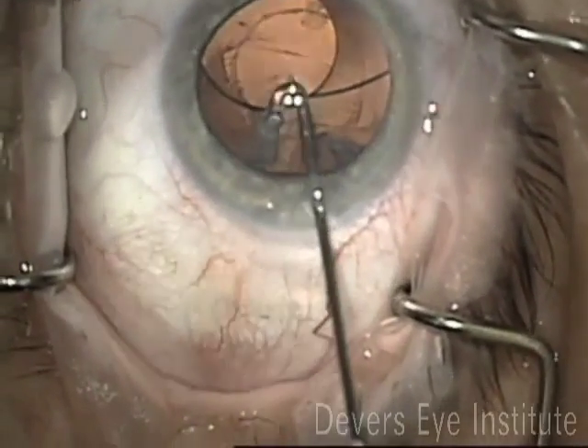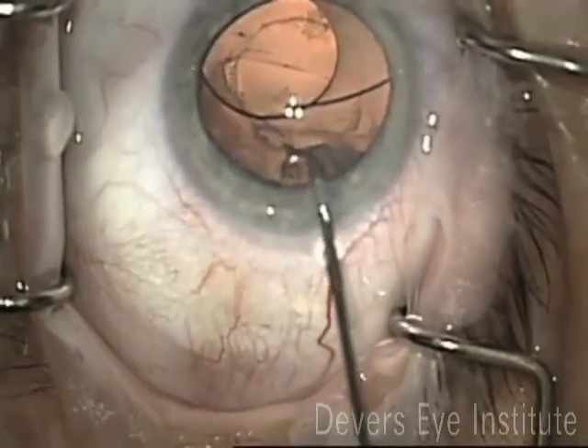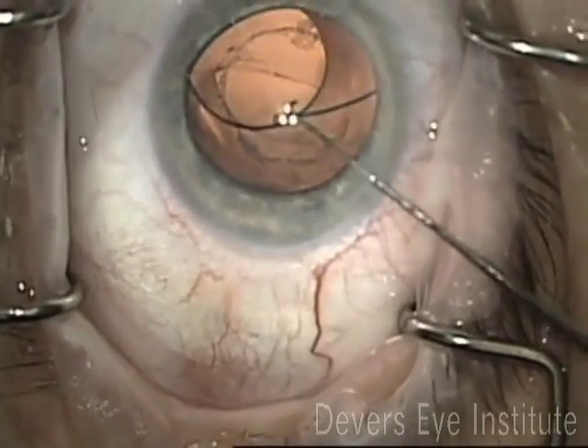Next, we removed all of the cortical material using a dry technique with a J cannula. This is a nice controlled technique, very unlikely to damage your capsule or get you in any trouble with vitreous.